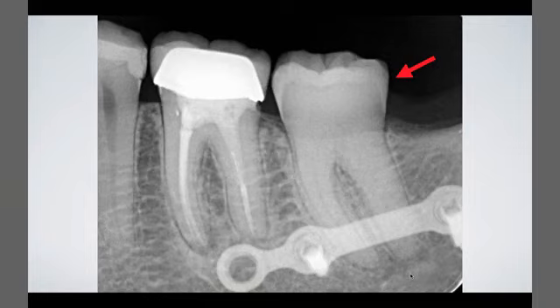So I did my examination. I took the periapical X-ray. I couldn't find any periapical pathology. I did the percussion test. Nothing is clear between the 6 and 7. Vitality test for sure is not a valuable test for calcified teeth because the pulp chamber is calcified. So the test is useless.